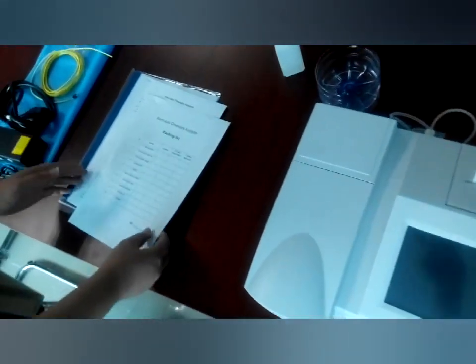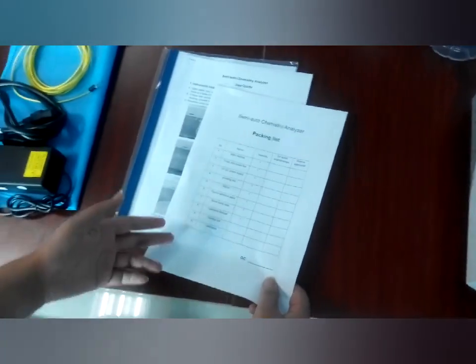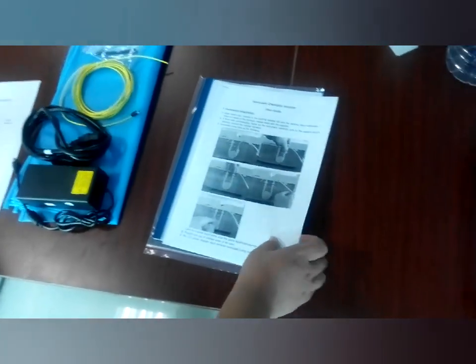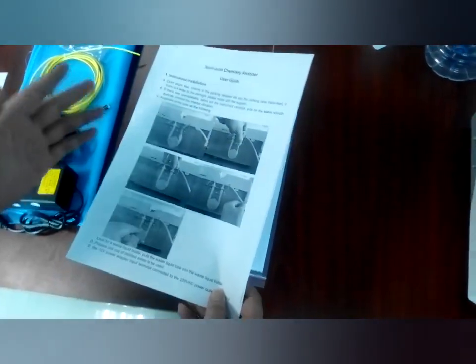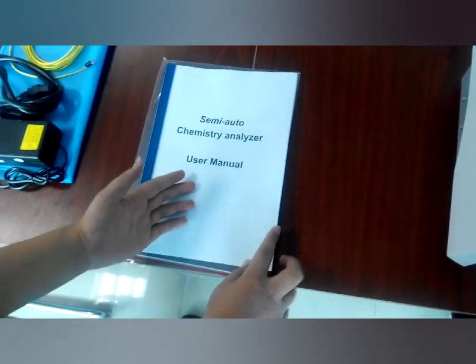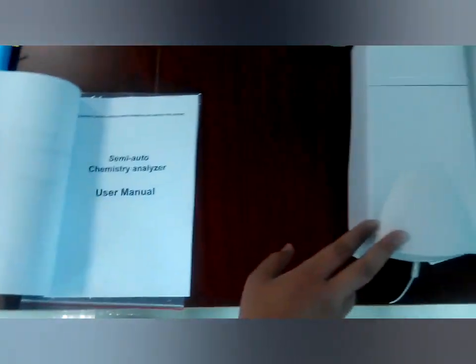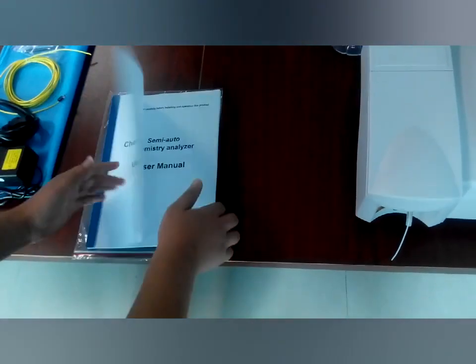There are three documents here. The first document is the packing list — from here you will see all the spare parts. The second document is the user guide, which simply introduces how to install and how to test using this machine. The last document is the user manual, which contains detailed information and answers to questions you may have during testing.